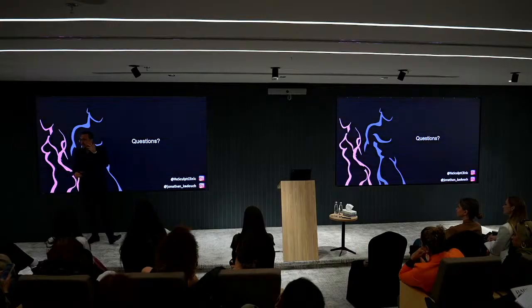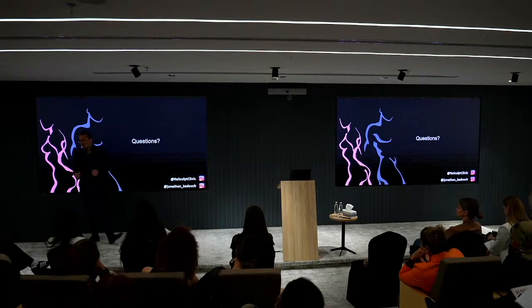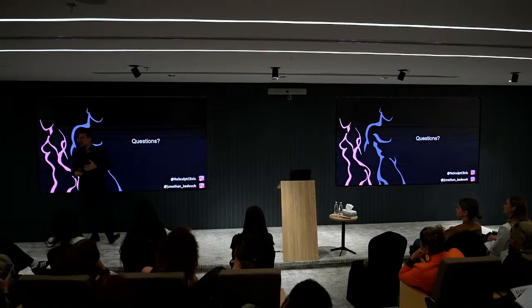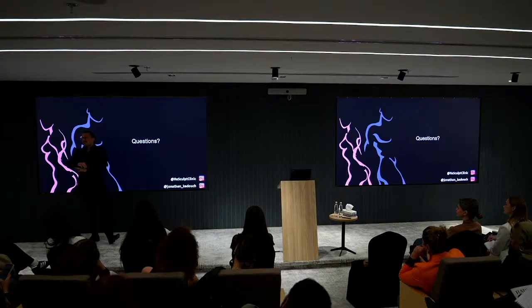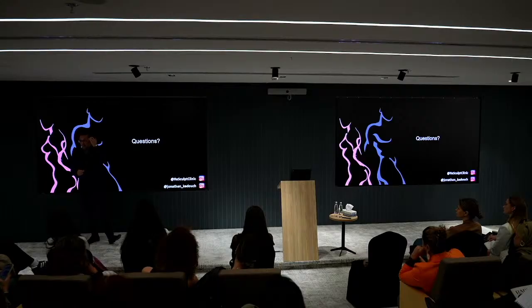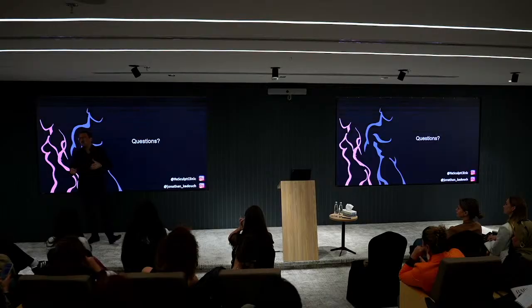The temples, you can still feel when you massage, but it's a little bit more difficult to spread the product. In that case, I don't need to lift anything because I don't have a problem with pressure. So in that case, I prefer using volume to get this even distribution and beautiful volume relation because I don't need any push or anything. So whether I do the cannula technique, and especially with the cannula technique, because I use 1 or 2 points, but I have to fill the whole temple, the whole fossa, and I need a product which can actually spread out to the area.